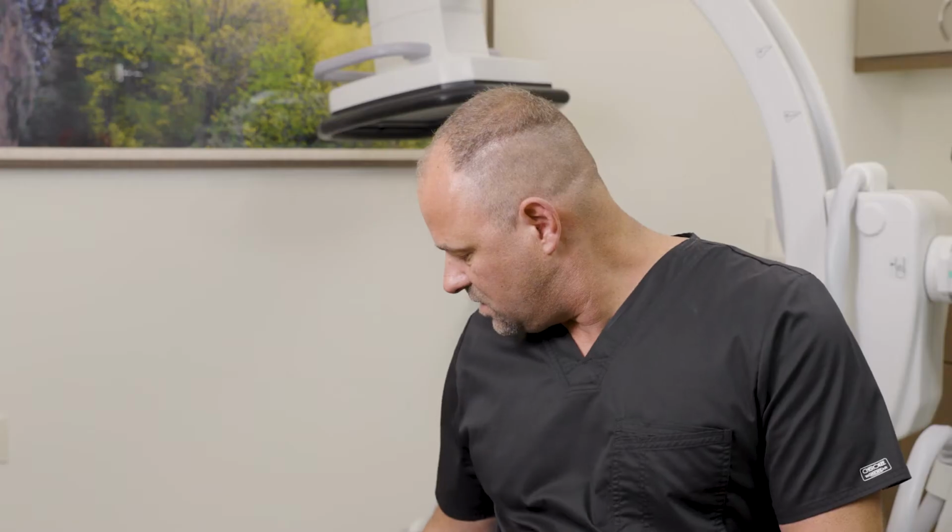One of the things that we're going to be using to help do this, so this is basically a wire, and these wires are floppy and they're relatively long. So if this wire is going to be this long wire, it's kind of scary, but basically this is going to allow me to navigate around your plumbing in your body, which is basically what the arteries are. They're tubes and they're all connected, so I can get from one tube or one artery to the next one.